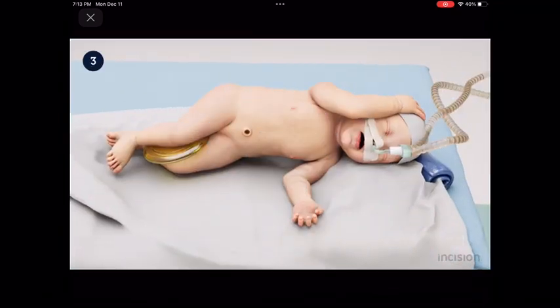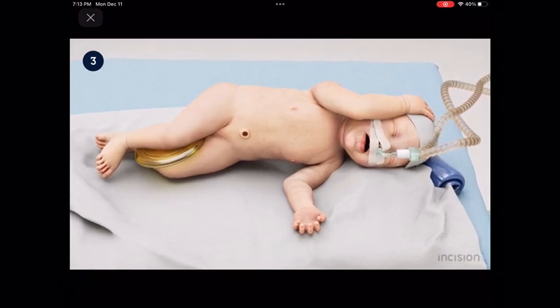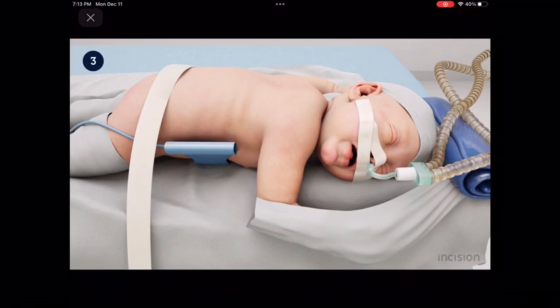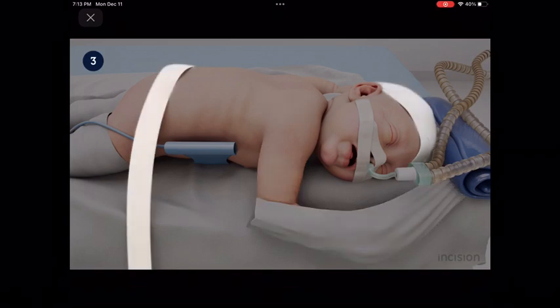Next, move the patient to a left lateral decubitus position to allow access to the right hemithorax. An alternative is a semi-prone position with the right side elevated using a longitudinal roll. The right arm hangs loose with the right scapula in slight external rotation. Secure the patient to the table with straps across the pelvis and the head.